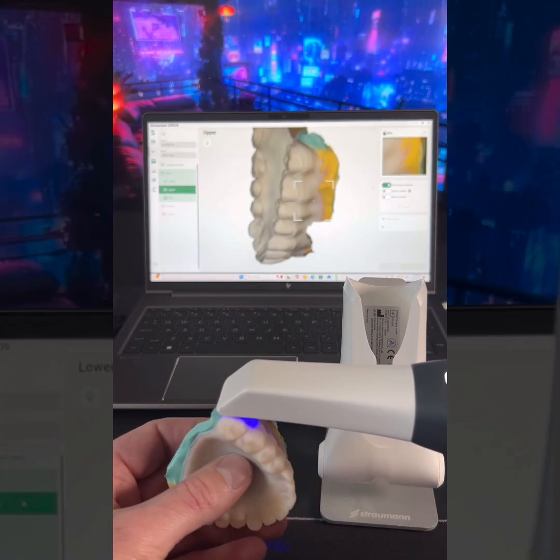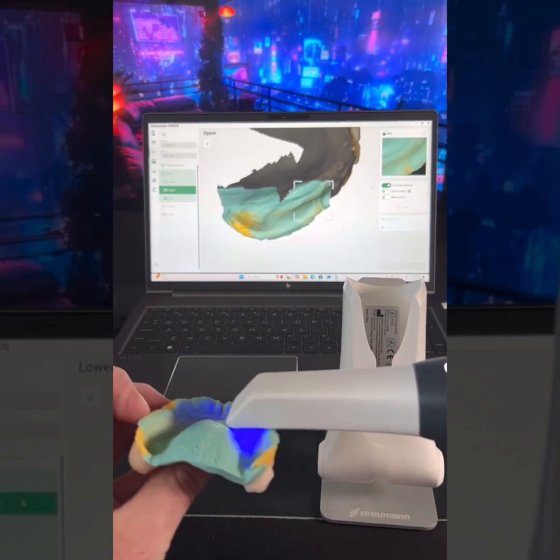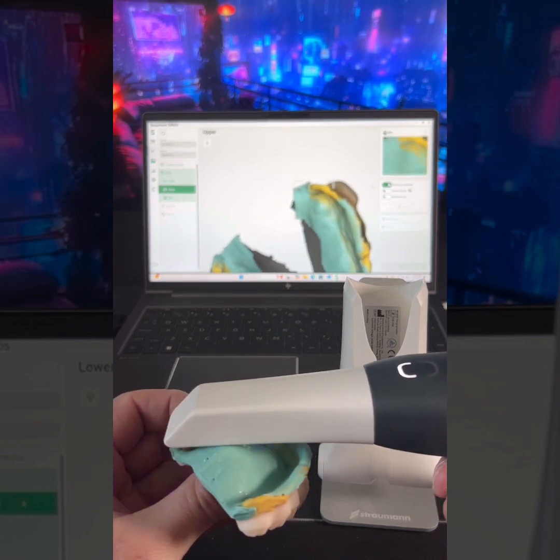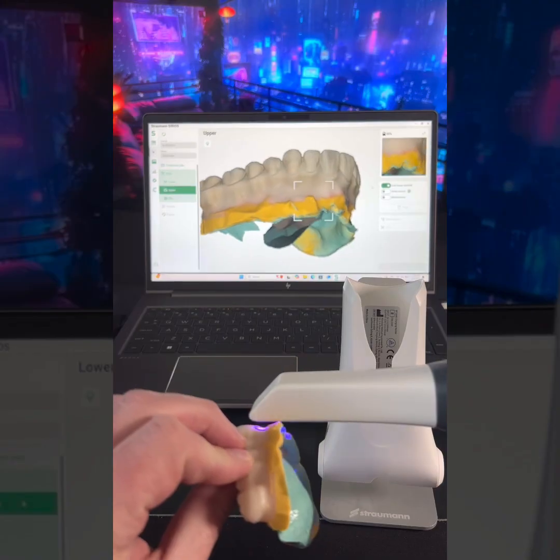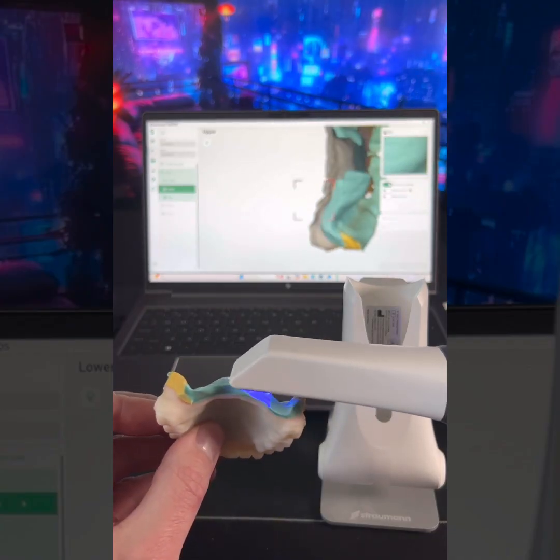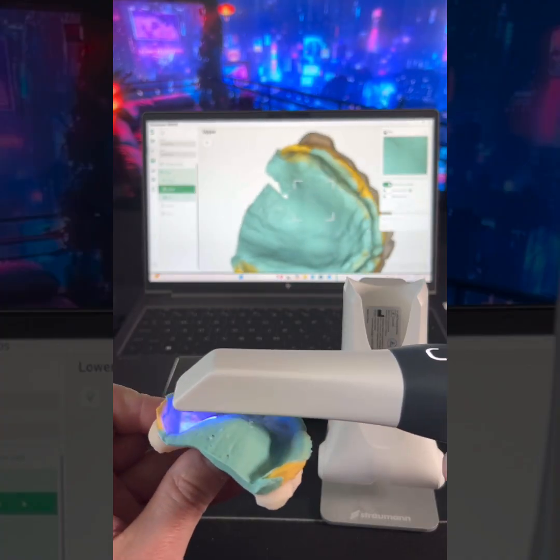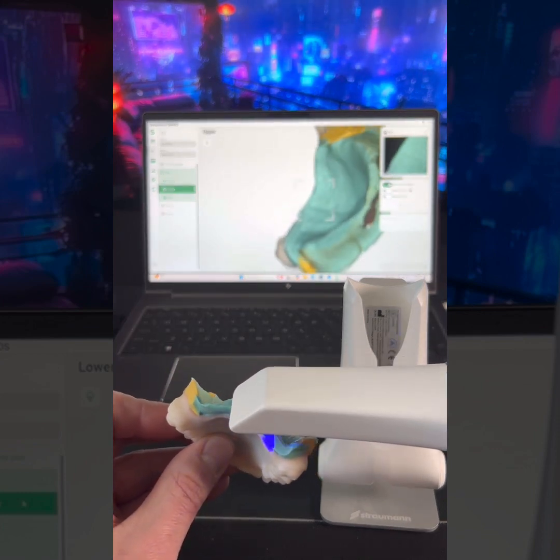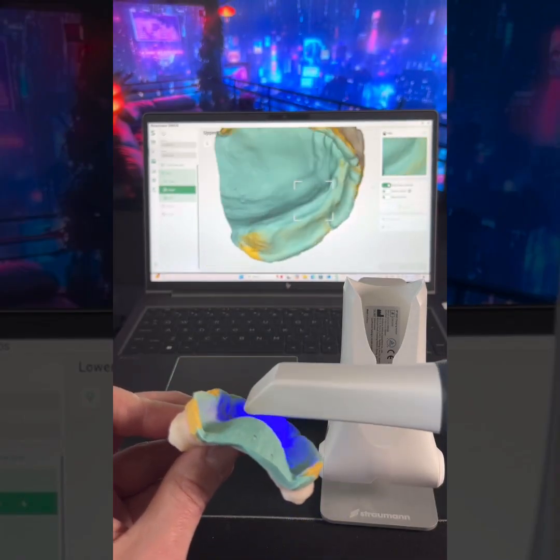Now let's see how we can transition here. I'm slightly touching it with kind of the middle part — I'm not touching it with the mirror, I'm touching it with kind of the shape — just to see if it can help me guide myself. It's working pretty well. I got hung up there, but this doesn't bother me because it's doing a pretty good job. I can also get all these undercuts. This is usually the most difficult part, but it's doing pretty well.